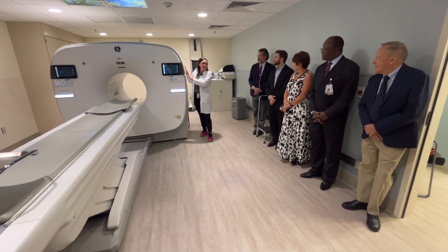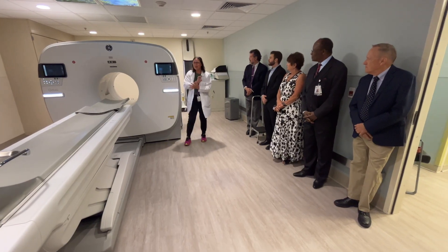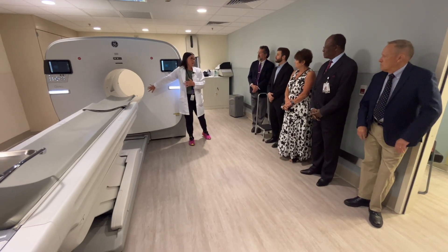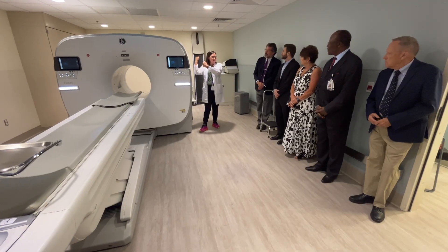So this is a PET CT scanner. Within this large gantry there is a diagnostic CT scanner — that's the front portion of the gantry. The PET component is in the back end of the scanner.